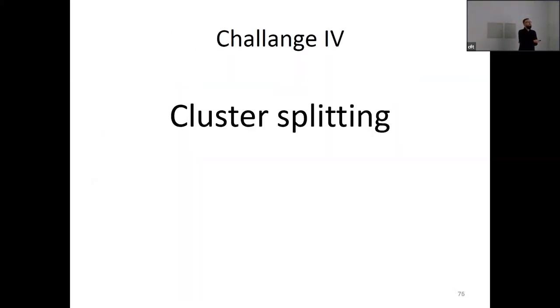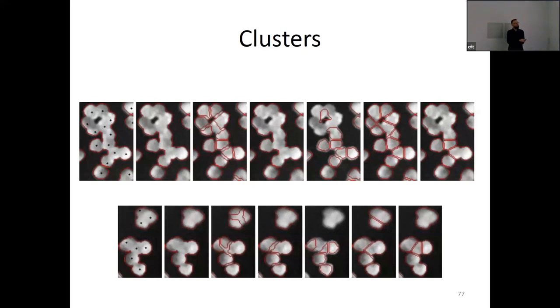Okay, challenge number four is the cluster splitting. So first of all, what are the clusters? Something like this. You have cells that are connected, and you have to split them to achieve good quantification results. So this is quite an easy cluster for segmentation.